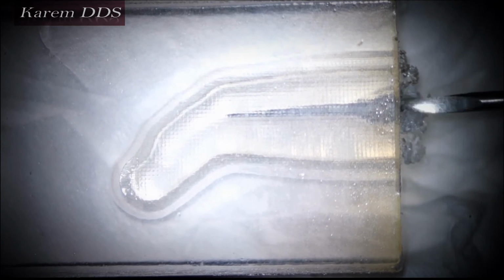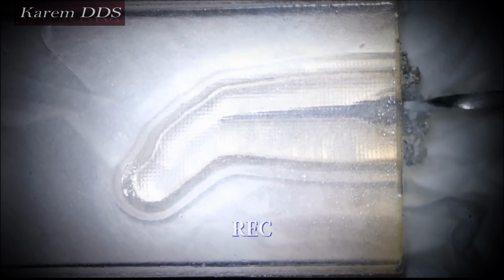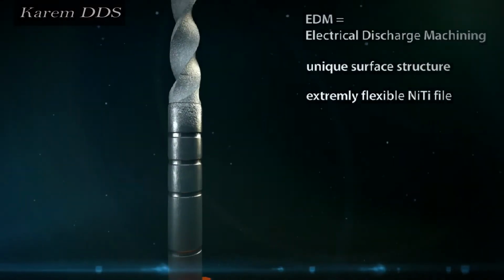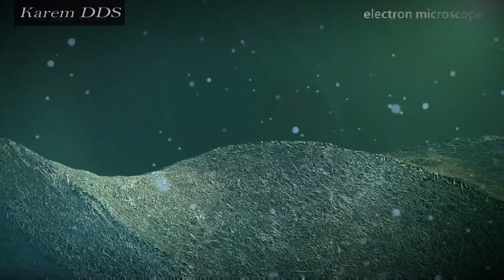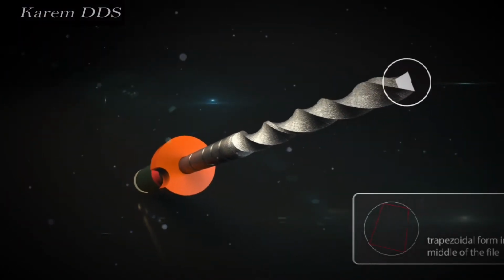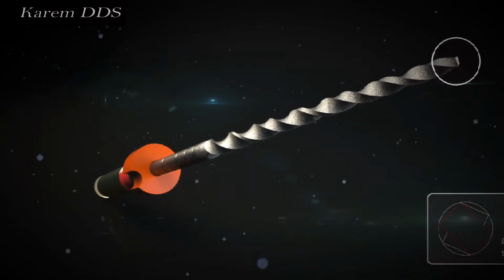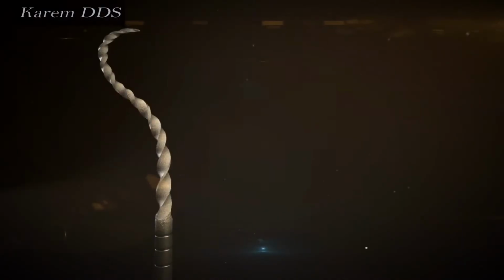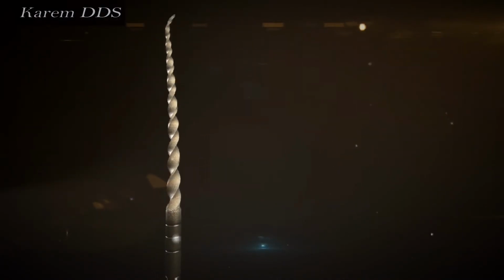After the coronal and middle thirds of the root canal are negotiated, small hand files are used to scout the remaining apical third of the canal. After this stage in the instrumentation of the root canal, it must be measured to avoid over-instrumentation.